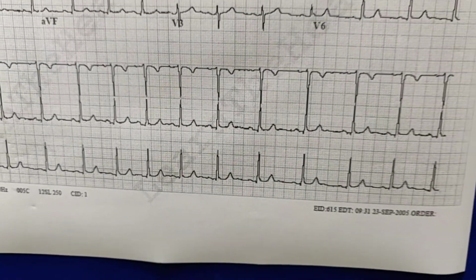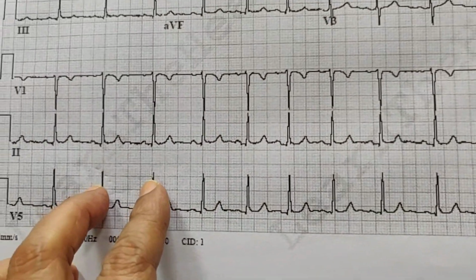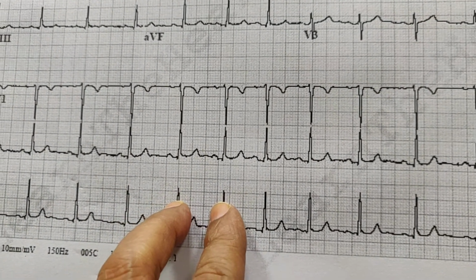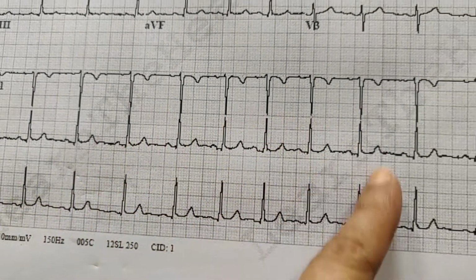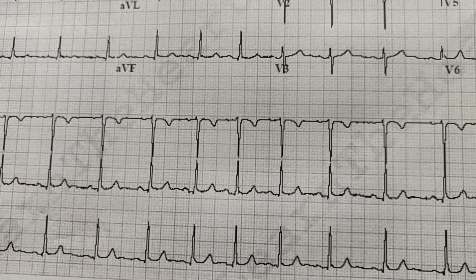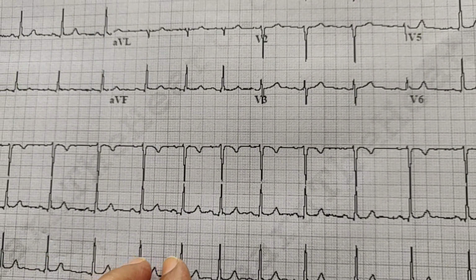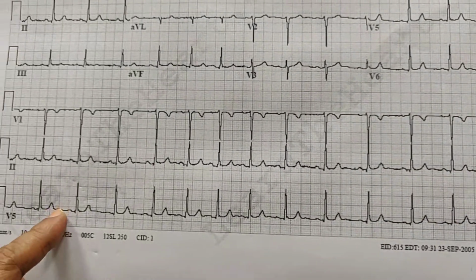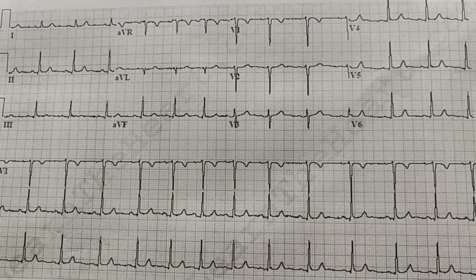I think this is sinus arrhythmia. Come on, see here the RR intervals are more, and here RR. Oh yes, so we are dealing with a sinus arrhythmia. You see how we define sinus arrhythmia? This is respiratory variation. You see, this is crowding of the RR complexes here. This is a little longer. Can you see my fingers like this? And then suddenly this is small, and this is again longer. And PR interval is constant everywhere. So this is a sinus arrhythmia.